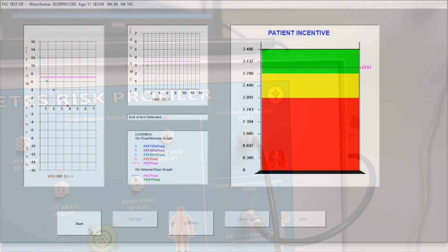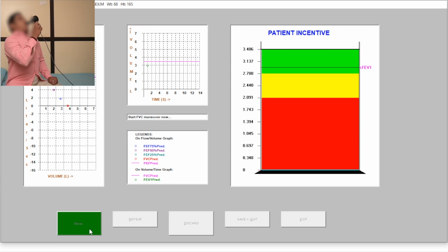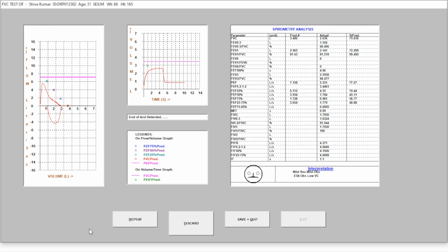Diabetic patients need to undergo regular spirometry to assess their lung function, as diabetes can lead to respiratory problems. Spirometry measures lung function by assessing airflow, enabling healthcare professionals to identify patients at risk of developing respiratory issues.